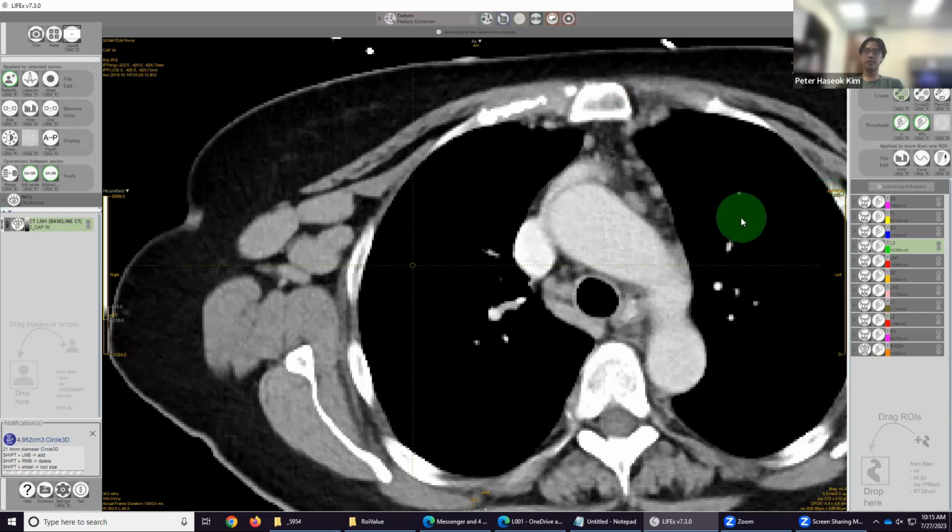So Dr. Yuri has a paper on harmonization to offset scanner-associated bias. And to do that, it's a very simple linear regression model that he runs for all of the tissue samples. The reason we're doing 3 separate ranges is to collect a variety, like equivariance, of points on the linear regression. The wider, the better.